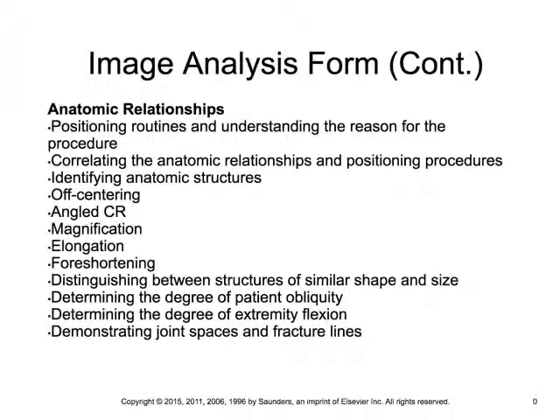So we're not expected to read these images for pathology necessarily, but we do need to make sure we have all the correct anatomy. If it's off center, if it's angled, if it's magnified, foreshortened, any of that stuff, we need to be able to identify that.